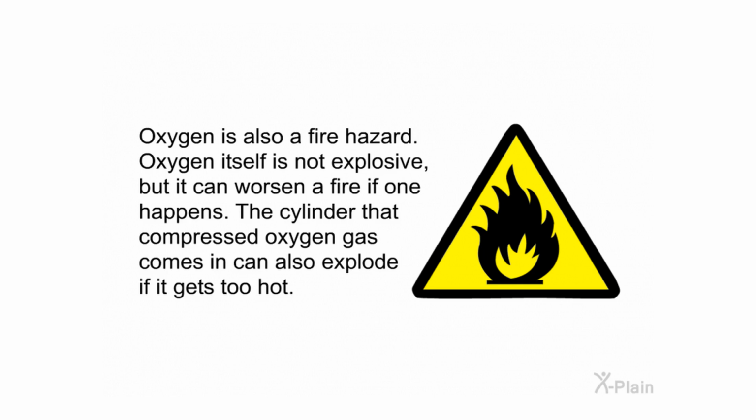Oxygen is also a fire hazard. Oxygen itself is not explosive, but it can worsen a fire if one happens. The cylinder that compressed oxygen gas comes in can also explode if it gets too hot.